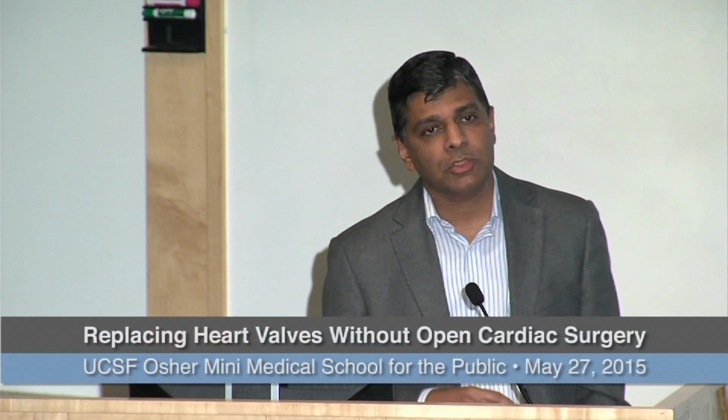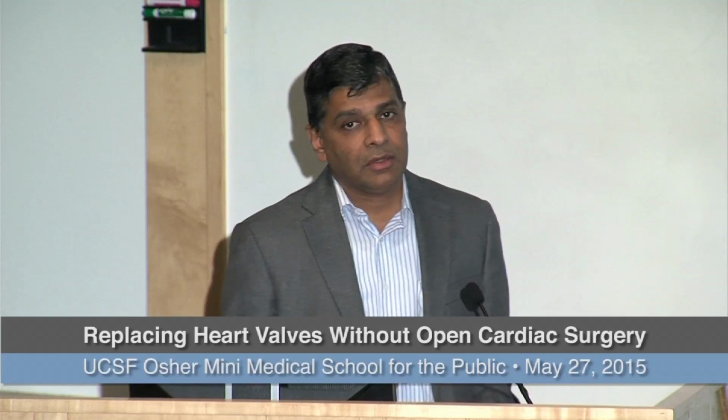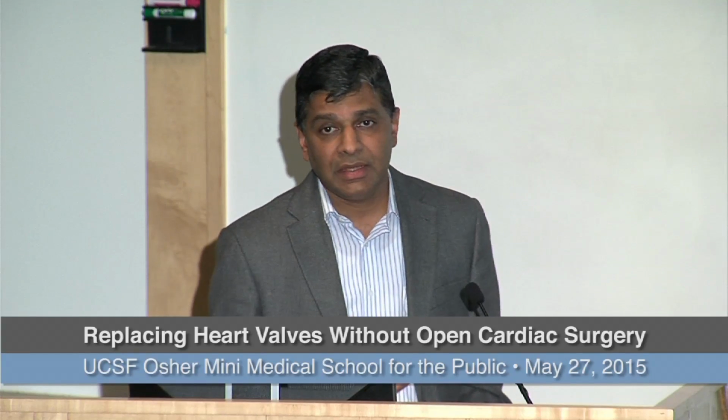Again, children born with these holes, if it's a very big hole, need emergency heart surgery as a child. But some of them with smaller holes, when they become a bit older or grow into adults, we can close with devices. As I said, patent foramen ovale is present in 25% of the population. I will show you some images of a patent foramen ovale closure, because this has almost become a day procedure now. You can close a hole in the heart without the patient even having to stay overnight. This is indicated for closure in patients with stroke with no other risk factors.